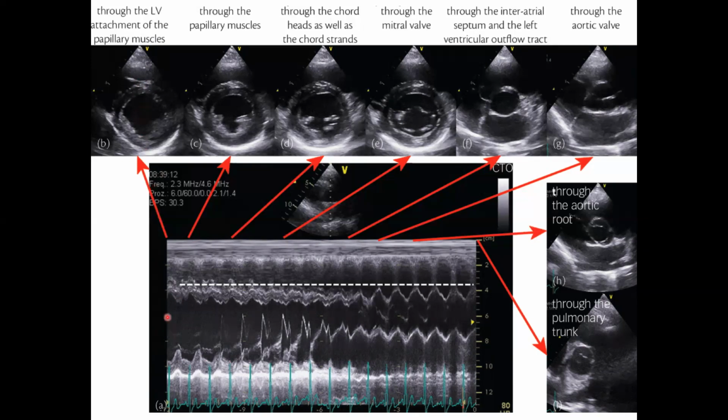Okay, so this is moving in. This feature down here is when this piece of tissue moves in this way. And so you can see cardiac contraction over one chord through the left ventricle with ridiculous time resolution here, right?